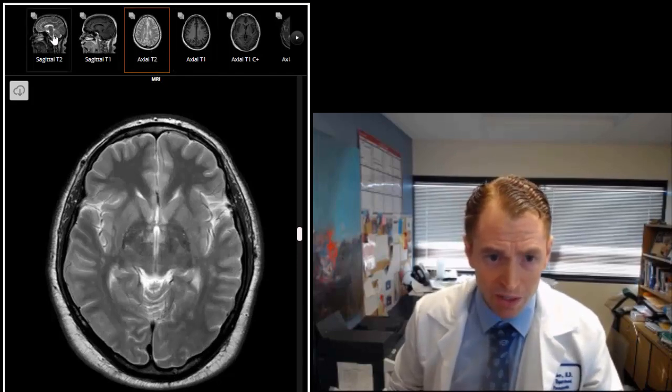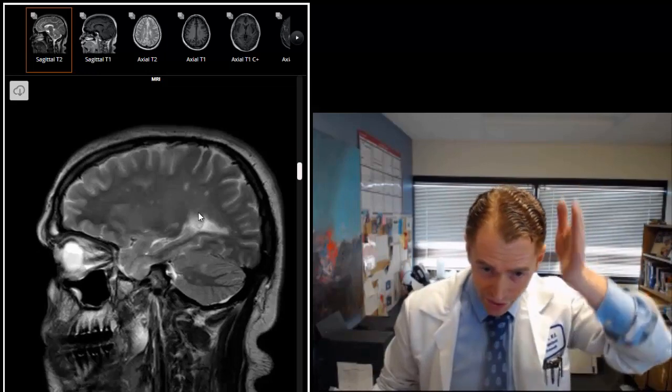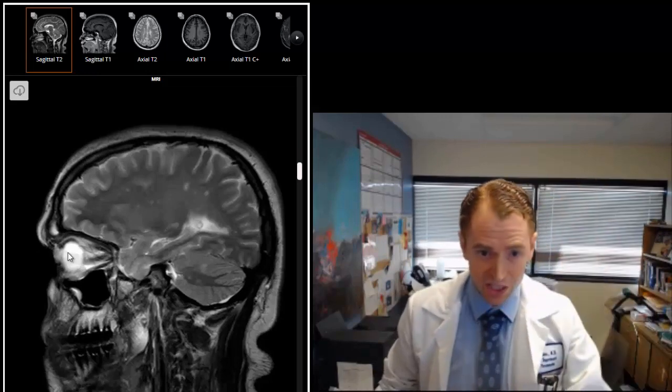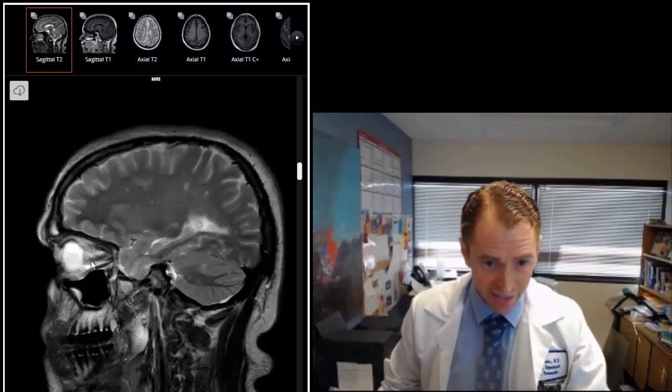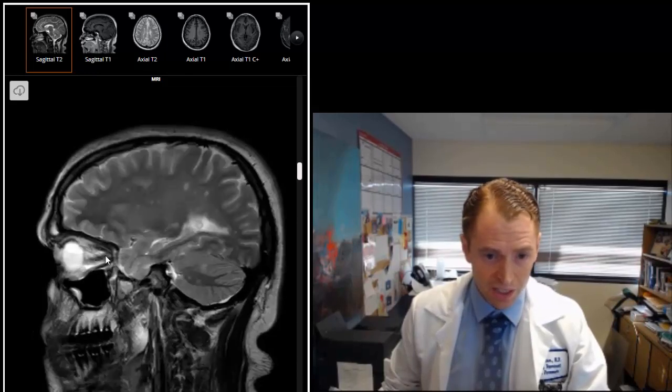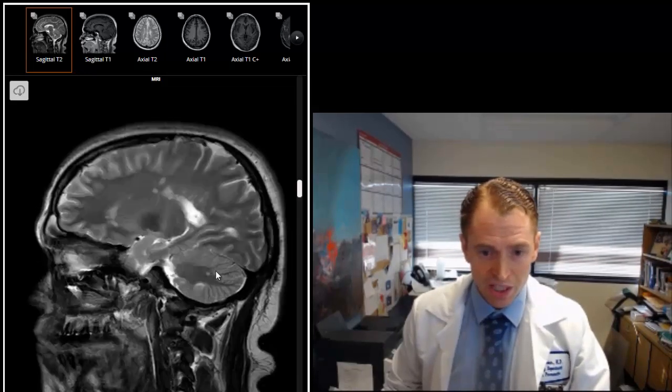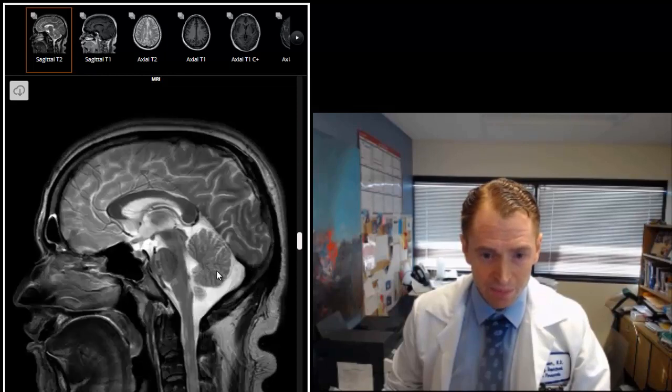Now we'll look at some other sequences. These are sagittal images so we're sort of looking at slices through the brain like this. So this is the eye. These are sort of the extraocular muscles. For instance, this is the lateral rectus that moves the left eye to the left. You can see the teeth here. You can see the cerebellum in the back of the brain. You can see the brain stem and spinal cord.